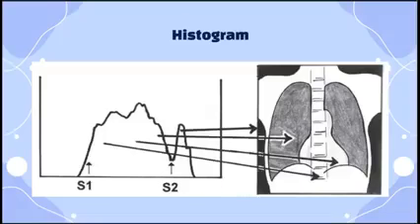Other variables which can throw off the histogram analysis include positioning and collimation errors, unusual pathological conditions, removed or added anatomy, and artifacts such as prostheses that are present during the initial exposure. So, hindi lang itong tail na ito, which represents the pitch black background densities, ang maka-affect sa histogram and the final image itself. Okay, there are also other factors such as yung mga unusual pathological conditions of the chest, that will decrease the brightness and contrast of the image.